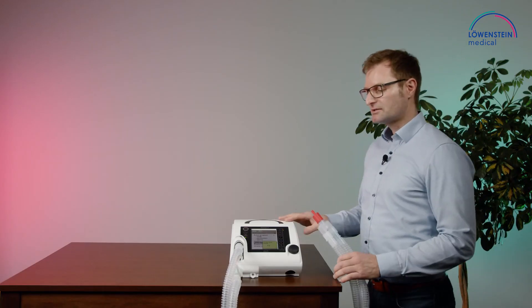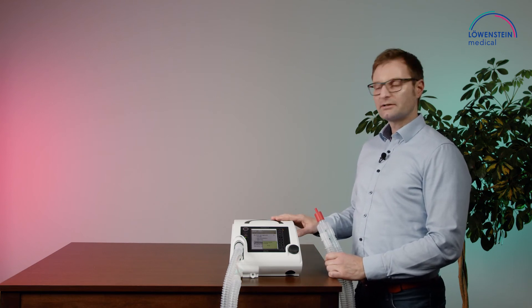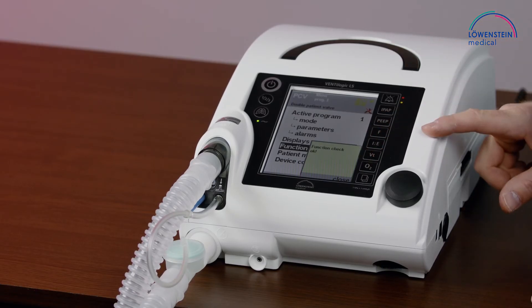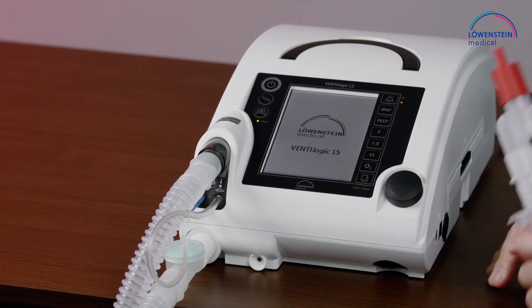The function check needs to be done every time the device is put to a patient or every month. Now the function check is okay, so we can close this message and start the ventilation.